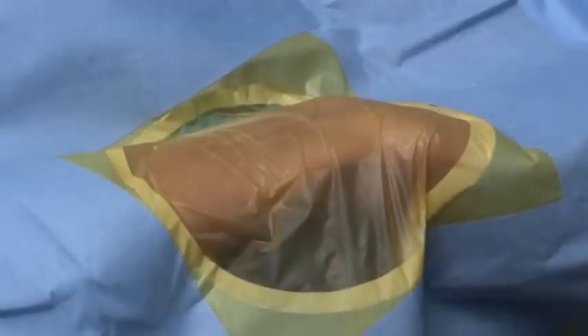This is the hyperextended wrist, and painting and draping has already been done. We are now all set for the radial puncture.